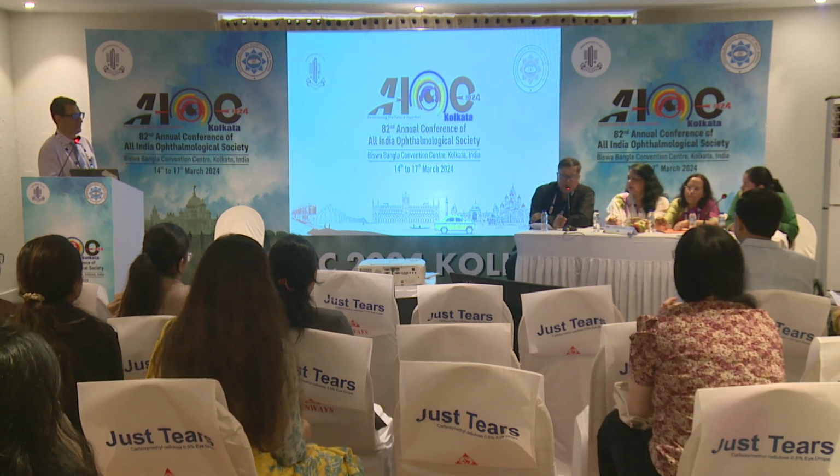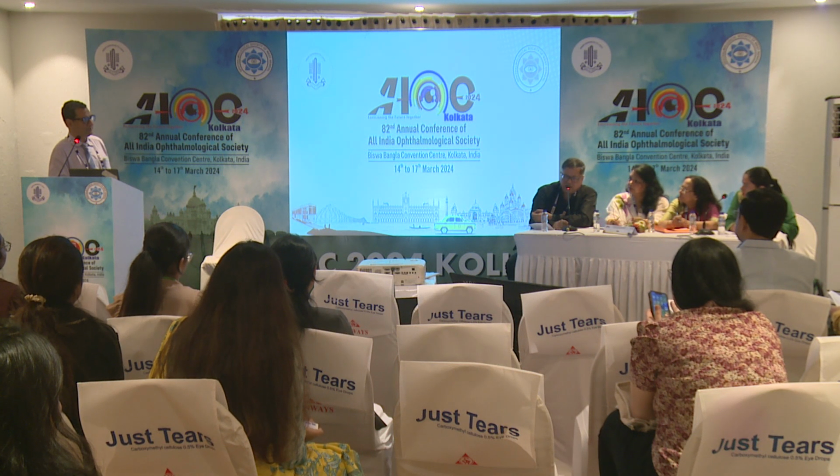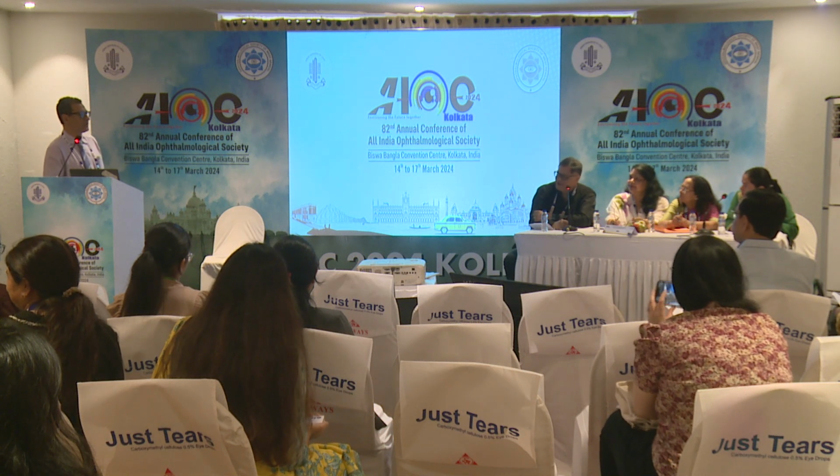The IOL that you retrieved from the vitreous seemed to have a broken haptic at some part. Yes, sir. In that case I didn't reuse the same IOL. We used separate IOLs. Okay.